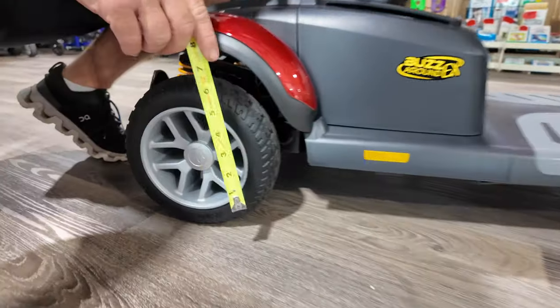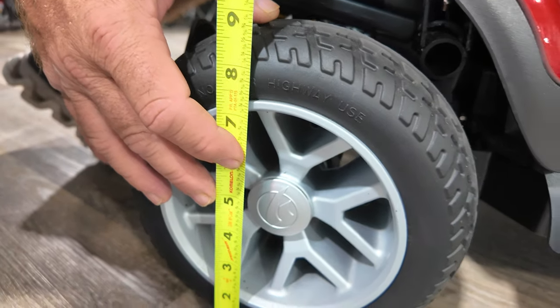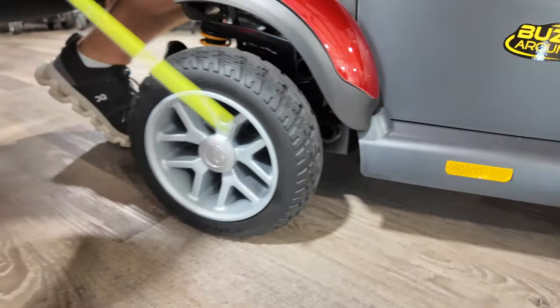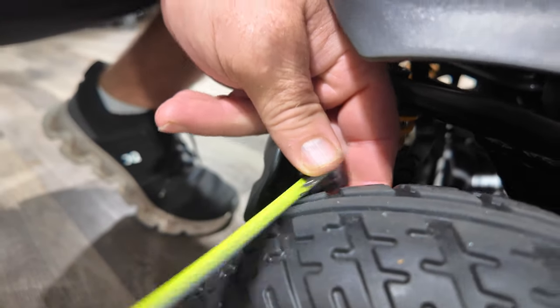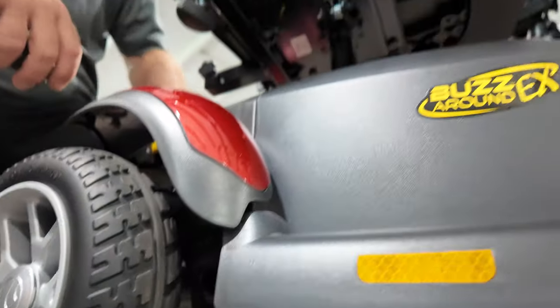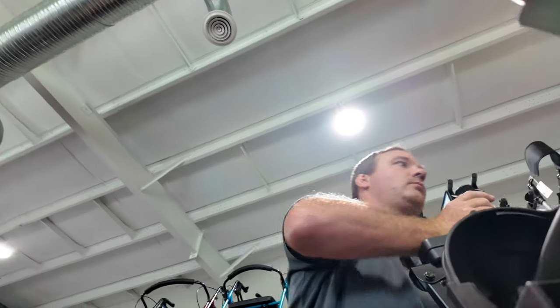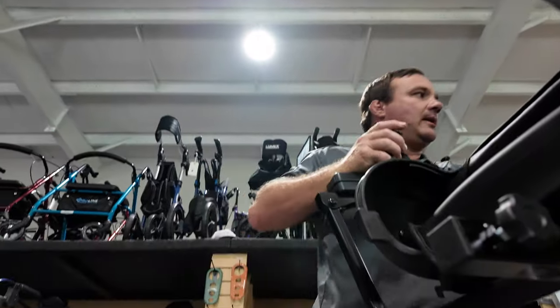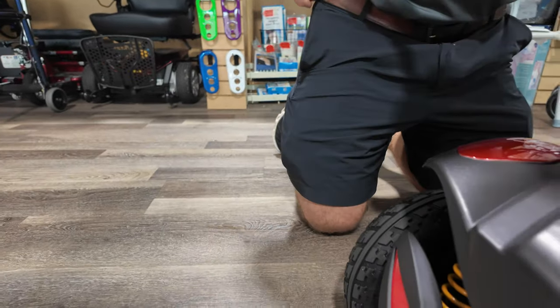It's not an overly big scooter — it's made to transport and holds up to 350 pounds. It's about eight inches across and about three inches wide on the tire. It's got full suspension at the rear, which is going to give you a smoother ride. It's also got a light at the back. Flip that light switch and you'll see it.